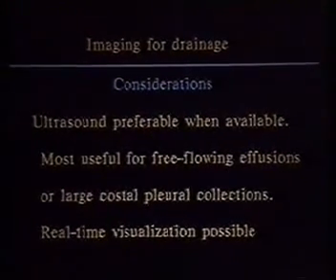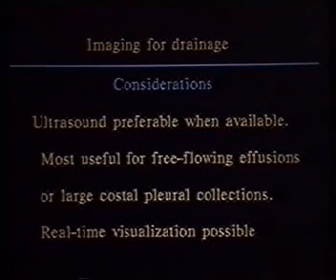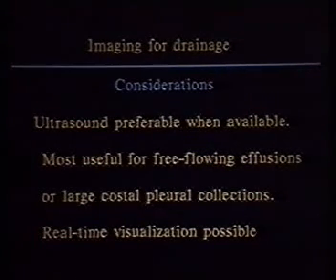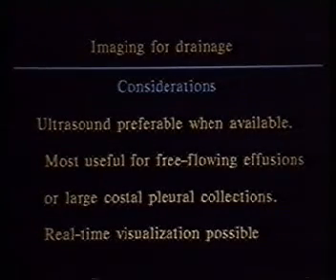In terms of the imaging for drainage, we have obviously available to us a number of different modalities which we use depending upon the clinical situation. Nowadays, we probably use ultrasound for the majority of our procedures. It's obviously very readily available to most radiologists. It requires no ionizing radiation.